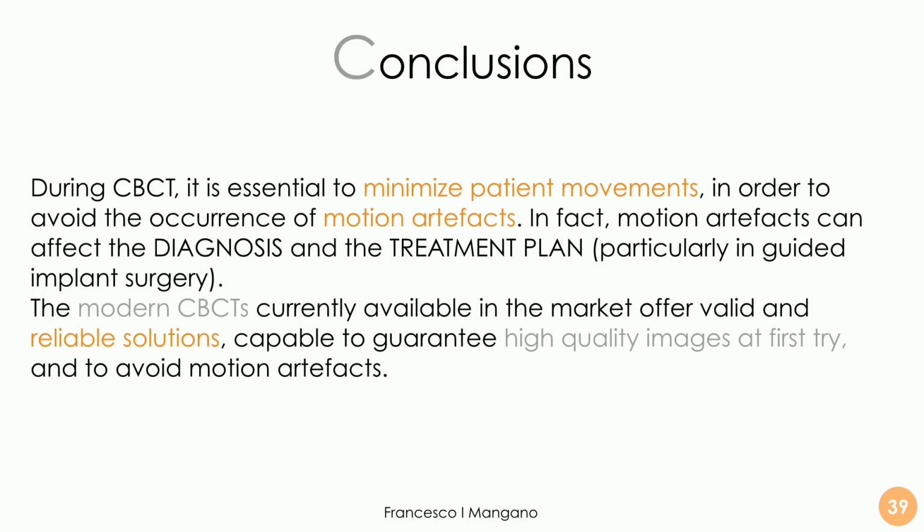And we know from some literature studies that patients over 50 years old more often move during the cone beam computed tomography, and the fact that they sit may help a little bit to reduce this risk and to avoid the occurrence of motion artifacts. So it's very important to obtain high quality images at first try, in order to not give another dose to the patient because we had some movement and some motion artifacts. This is key, particularly in surgery, but in all applications of cone beam computed tomography.